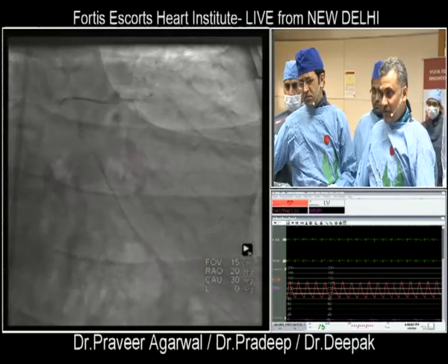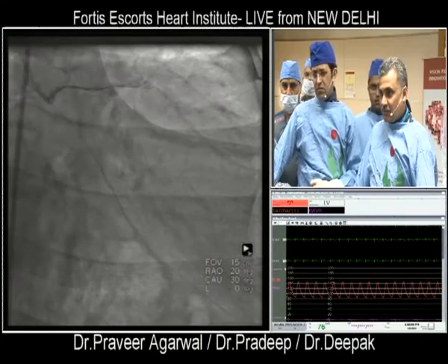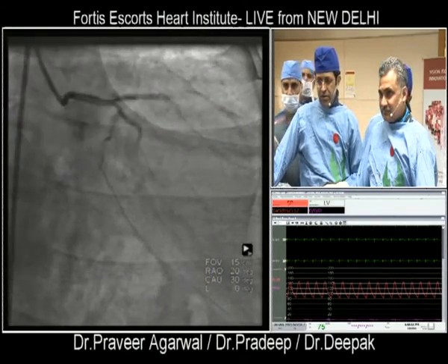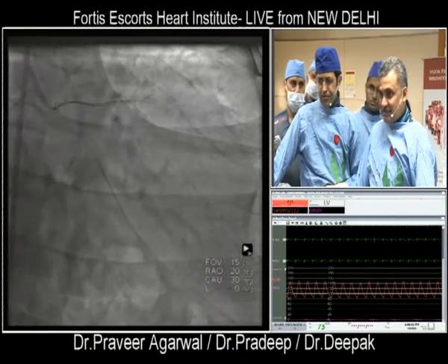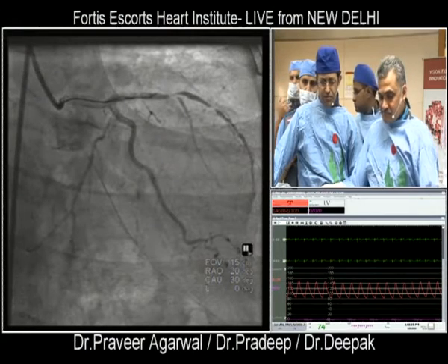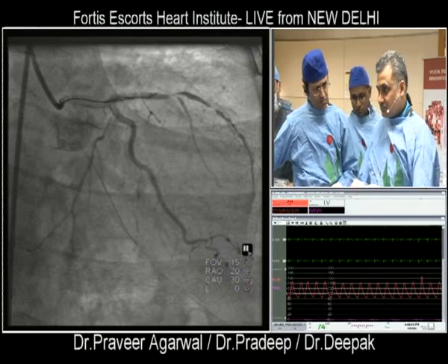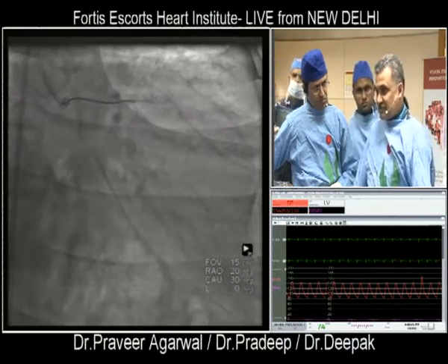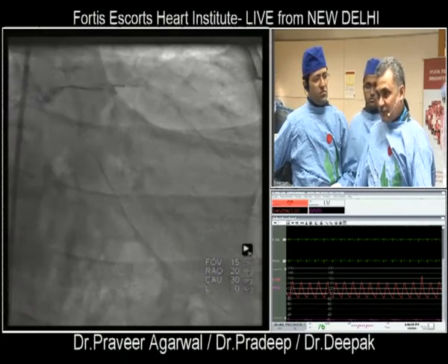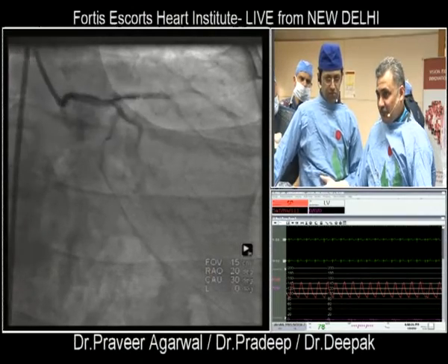So what I'm planning now is to just dilate very, very gently with a small balloon and see whether we can wire the diagonal. Is it all right with you guys? You take some risk, but you can try. Do you have any angled-tip microcatheter, like a Crusade? Yes, we have microcatheters. No, with the angled tip, like a Crusade, a SuperCross microcatheter. No, we don't have Crusade. Angled tip can help in this. Unfortunately, no, we don't have that.